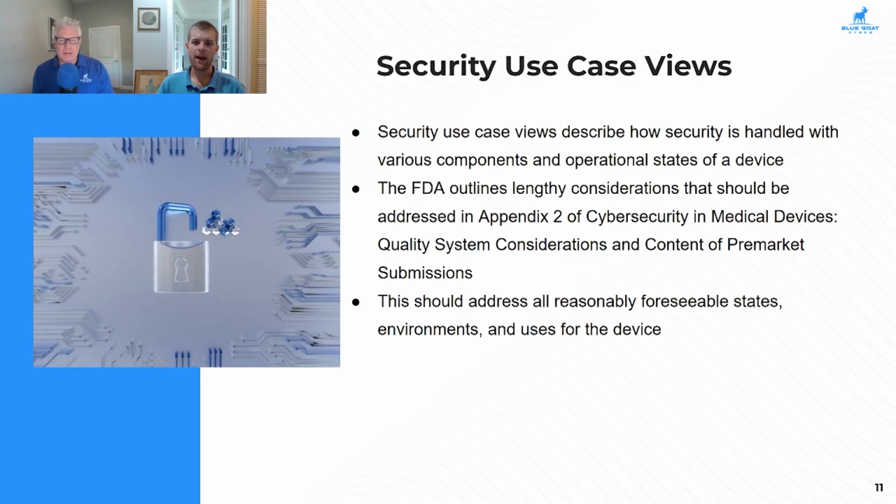We also have to think about some more edge case scenarios, such as updating. That can be an operational state of the device. Or like it's in maintenance mode or something like that. Yeah, maintenance mode. Are there any break glass functionalities? Or do things work differently if you power it off altogether or move it into, say, sleep mode, things like that?